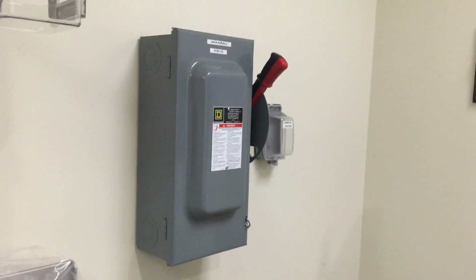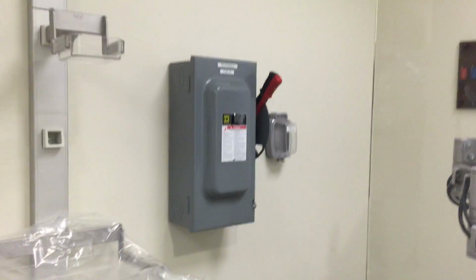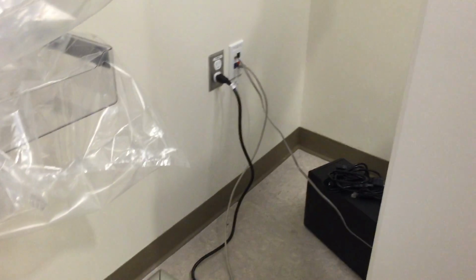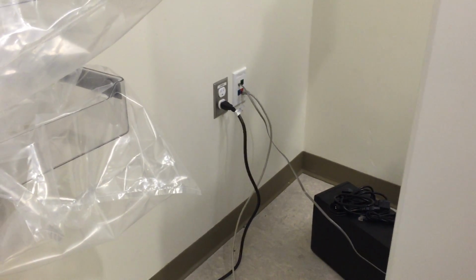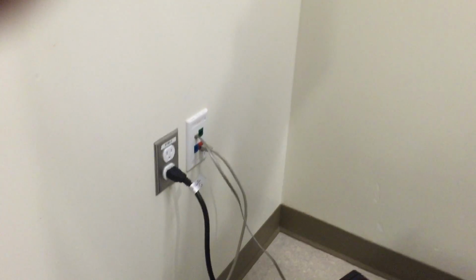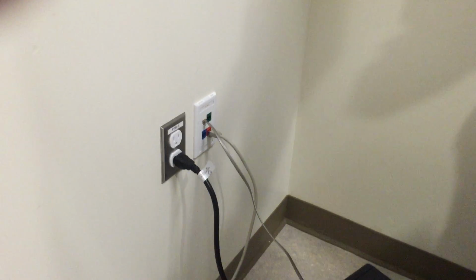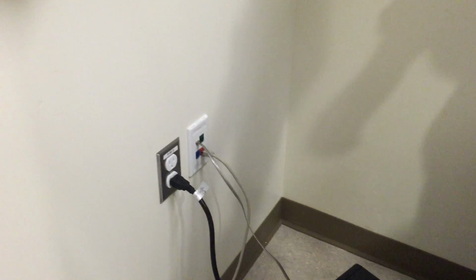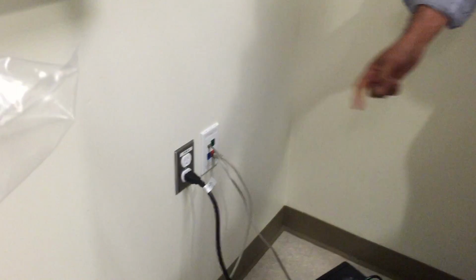Probably the local installation guys might know. Nima said this is only a one-day installation, and indeed it's only 110 volts, right? Yeah, standard 110. And you need only one data connection, this LAN, or two? Oh, one is for the phone. Okay, so one LAN connection only, for the network.